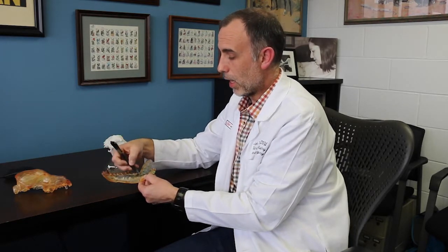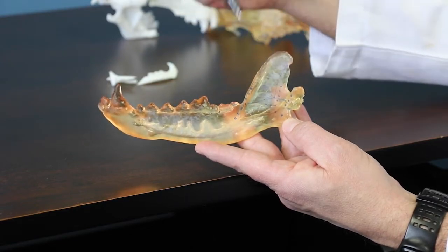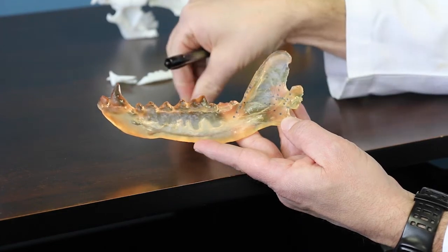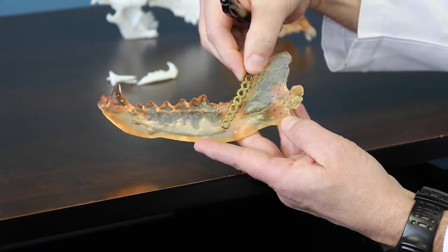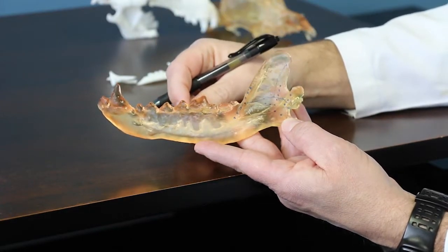And by doing that, we can then print that normal left mandible, and we can use this print, and by drawing the fracture lines on the print, we can then use the model to pre-contour some bone plates. By pre-contouring the bone plates, we have two advantages. One is that it speeds up the surgery time.